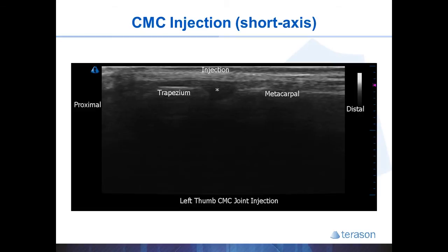Here you can see the target image and the needle location as it should appear in a short axis injection. It is a very superficial injection — in this example the target is only half a centimeter below the surface of the skin.